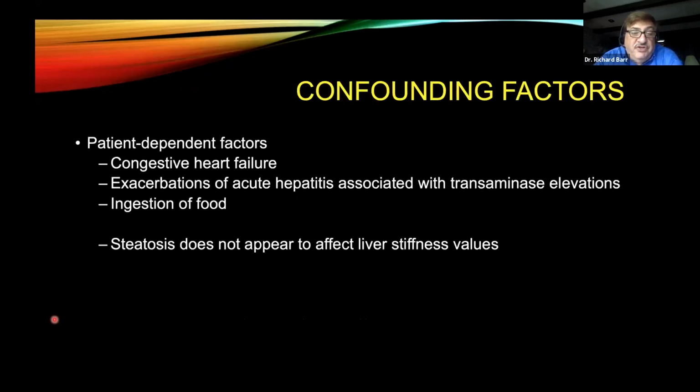Other confounding factors that are patient dependent include congestive heart failure. You have to remember that we do not measure liver fibrosis, we measure liver stiffness. And liver stiffness is a combination of fibrosis, congestion, and inflammation. So in congestive heart failure, or even in renal failure, people that have increased right heart pressure, a pediatric patient with a Fontan's procedure, the right heart pressures are going to be elevated. That pressure is going to be transmitted through the inferior vena cava and the hepatic veins, and it will make the liver stiffer. So if you use cutoff tables, you're always going to overestimate the degree of fibrosis.